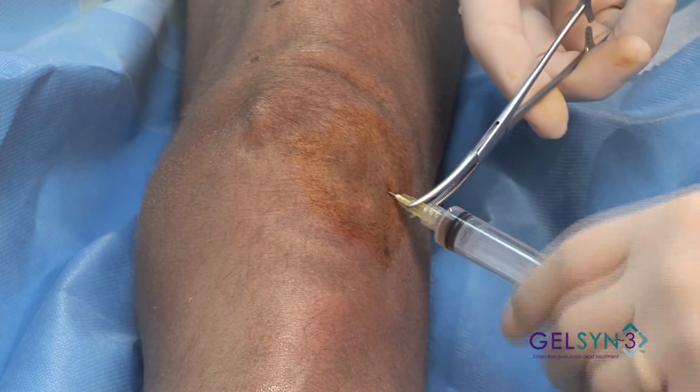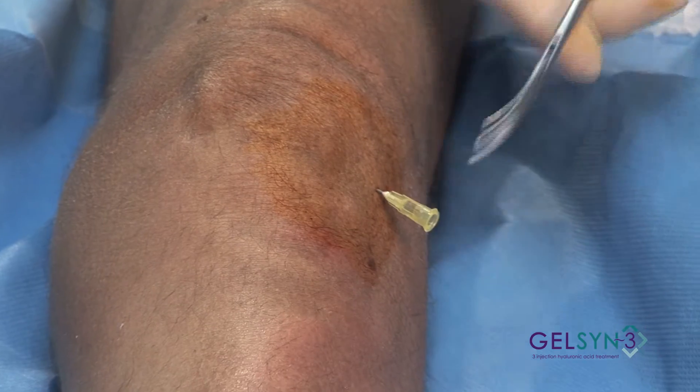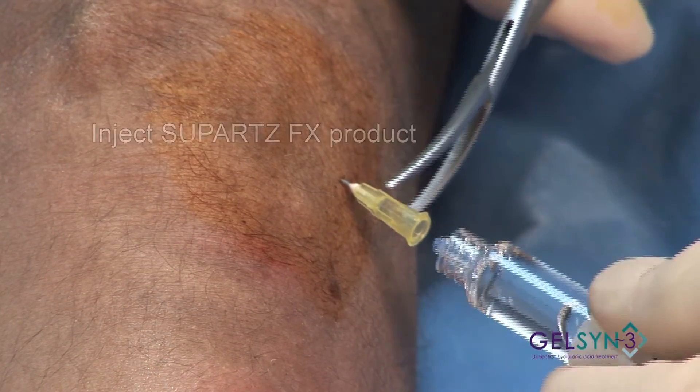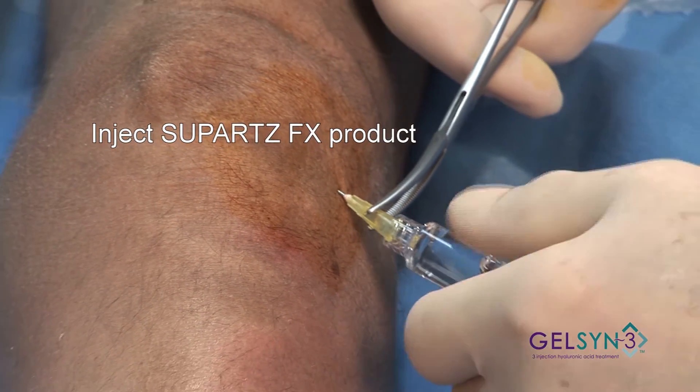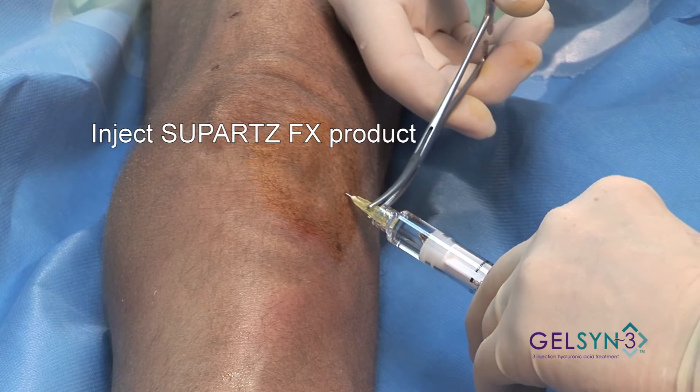We use our hemostats to steady the needle. We apply our syringe and inject.